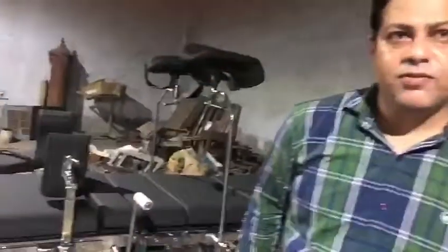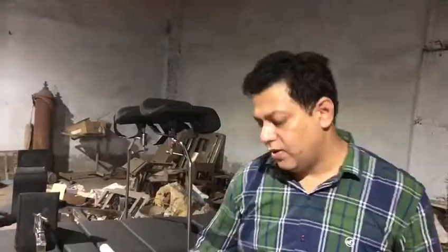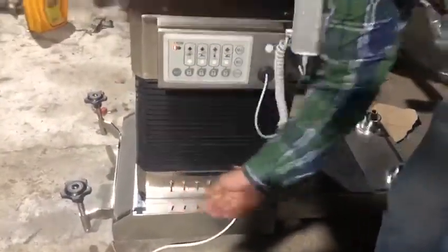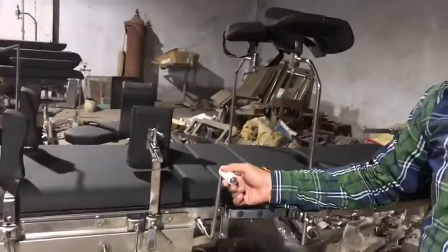And in rare times, if both the panels and the remote control fail, we have a manual provision as well down below. We have toggle switches that will be controlled by this handle.